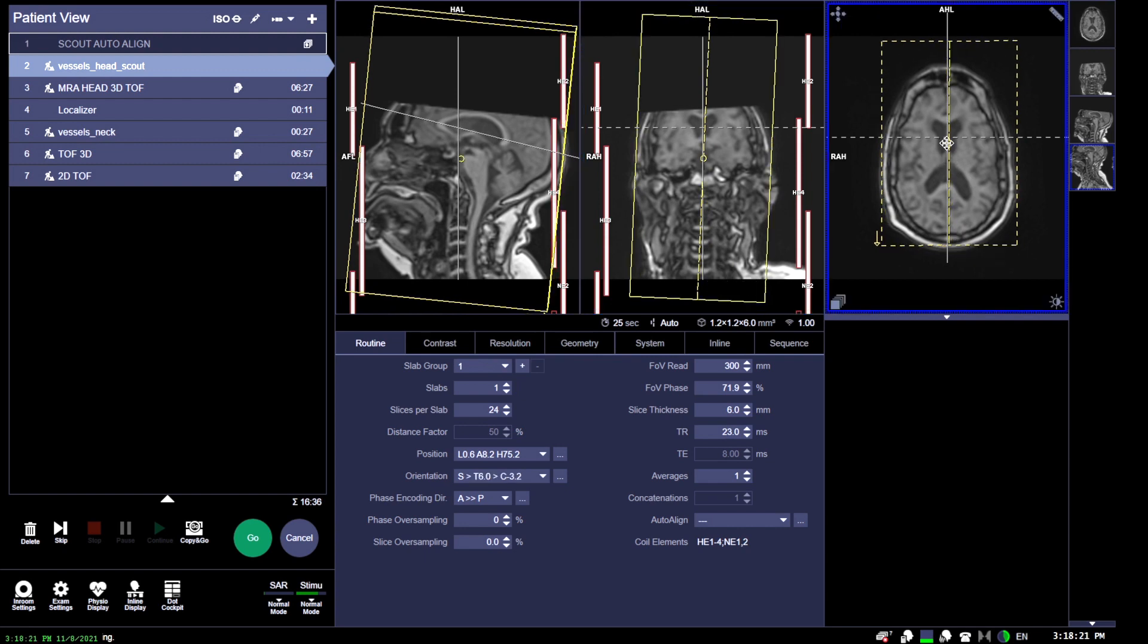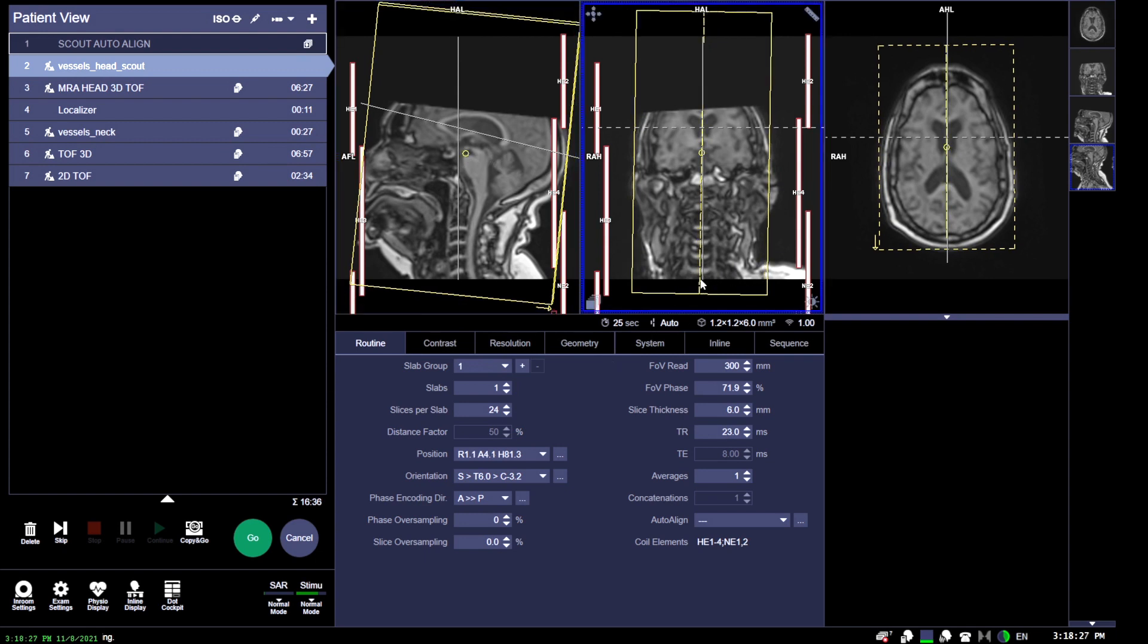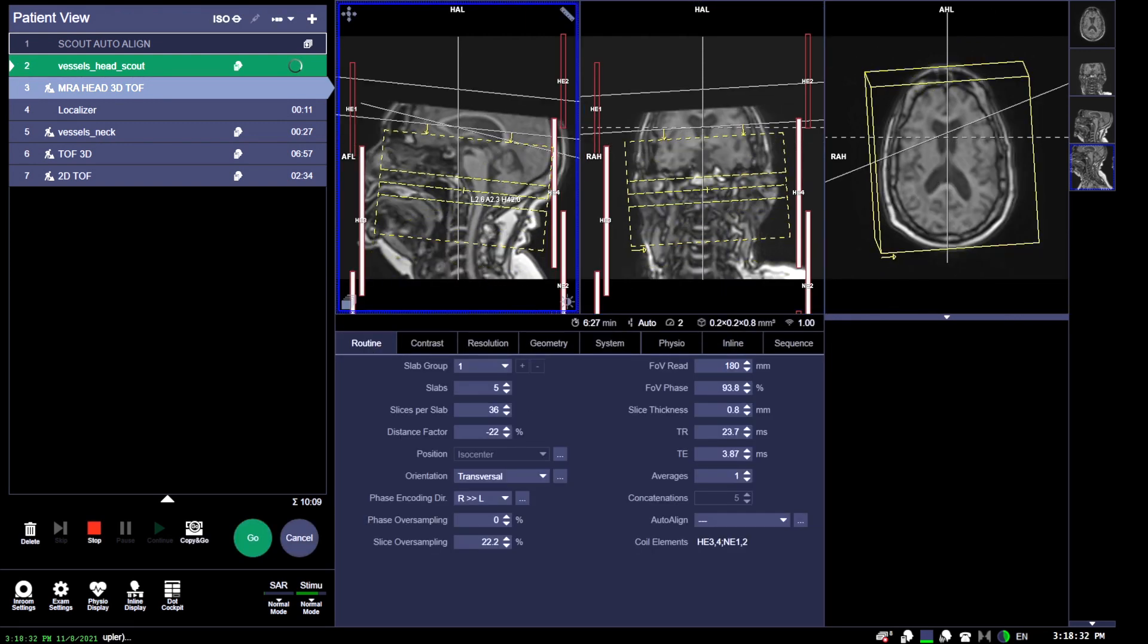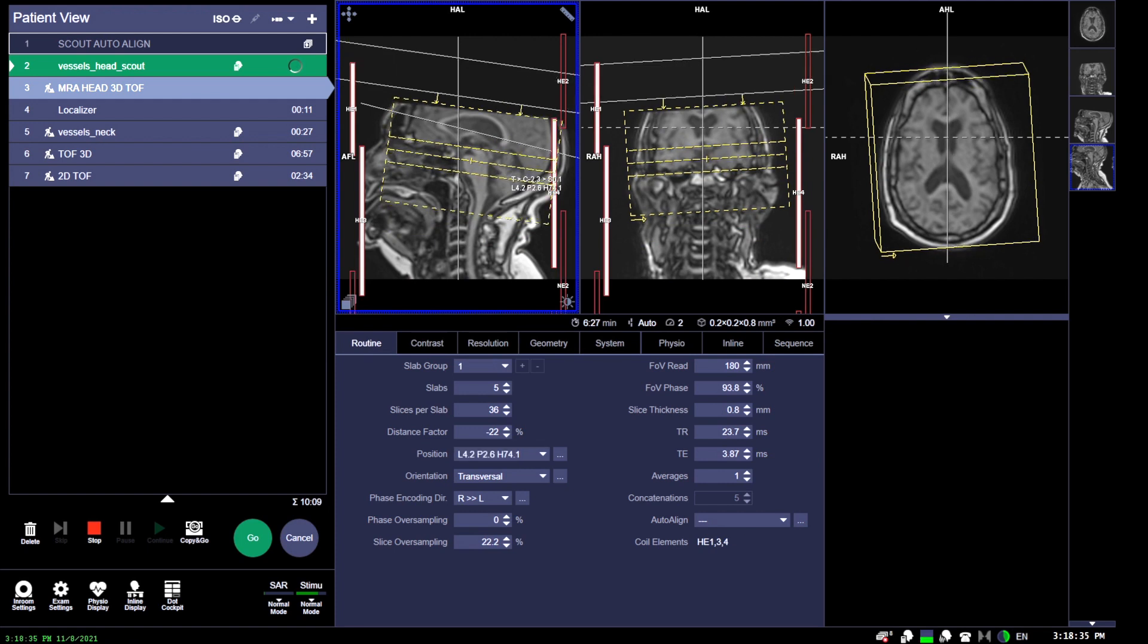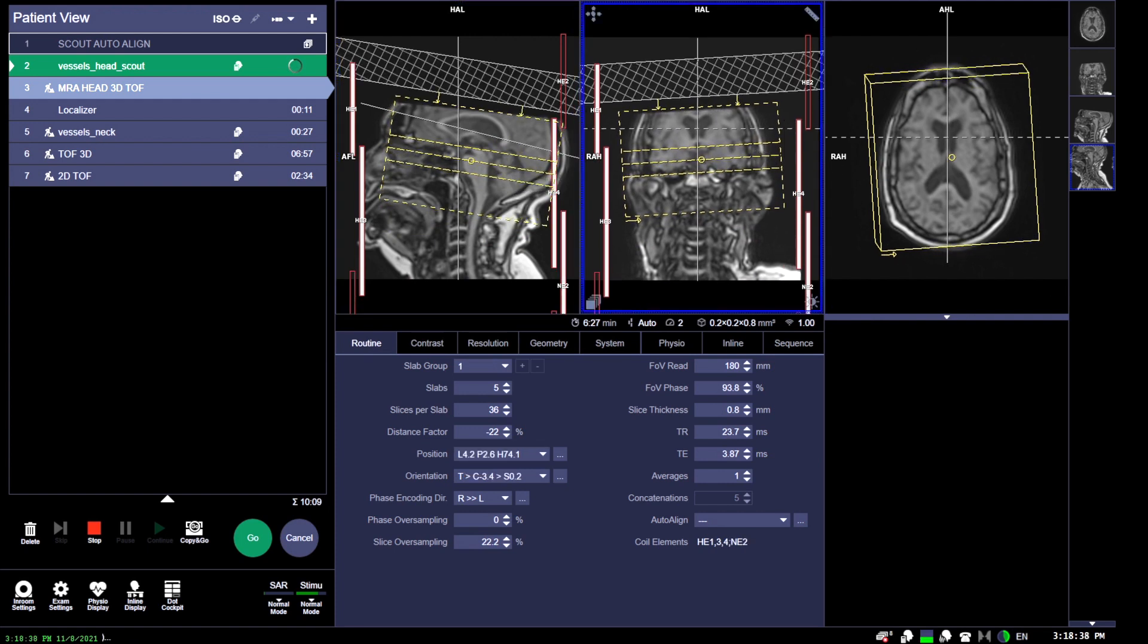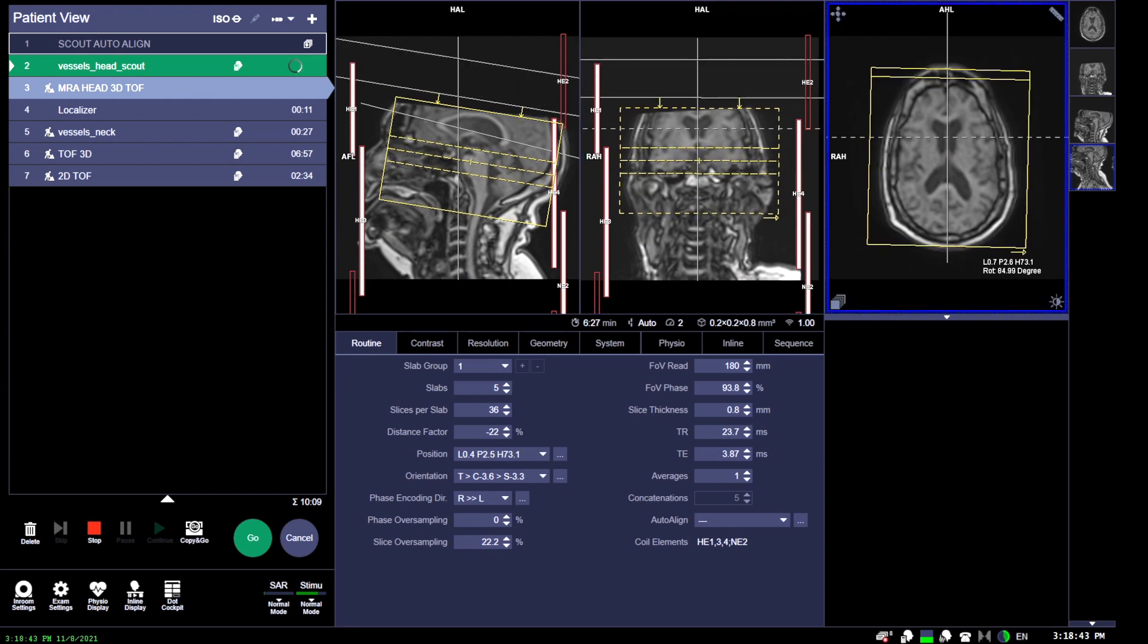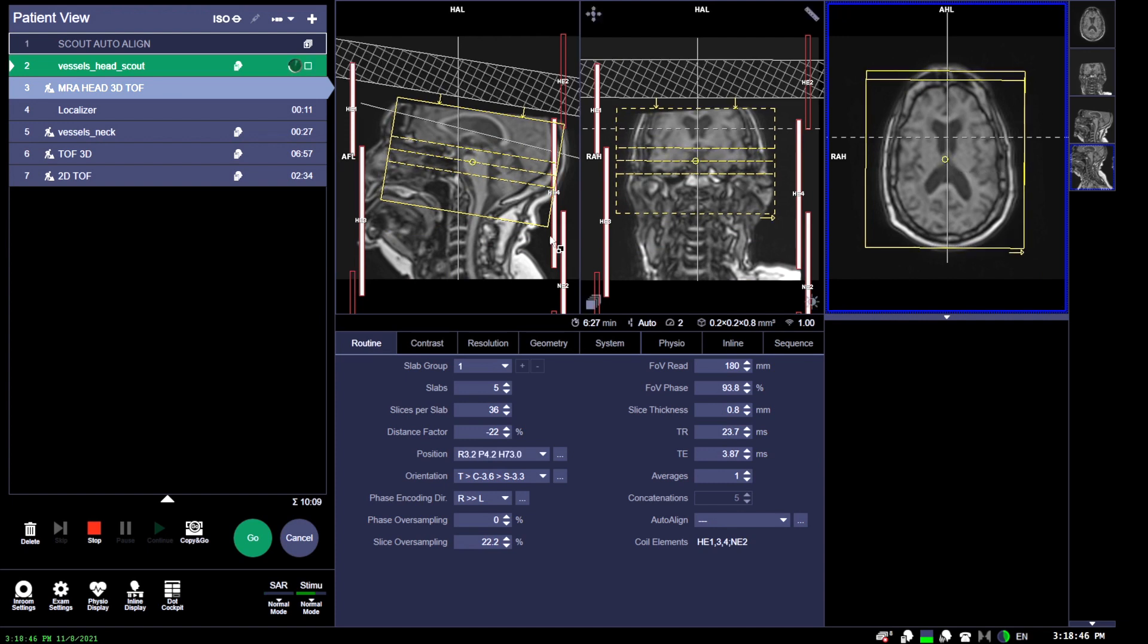What's going to be important here is saturation bands. Saturation bands are going to essentially obstruct the flow of venous blood flow and only highlight arterial flow. As you can see here, we have a saturation band that's superior, and that will saturate out any venous flow coming back down from the brain.